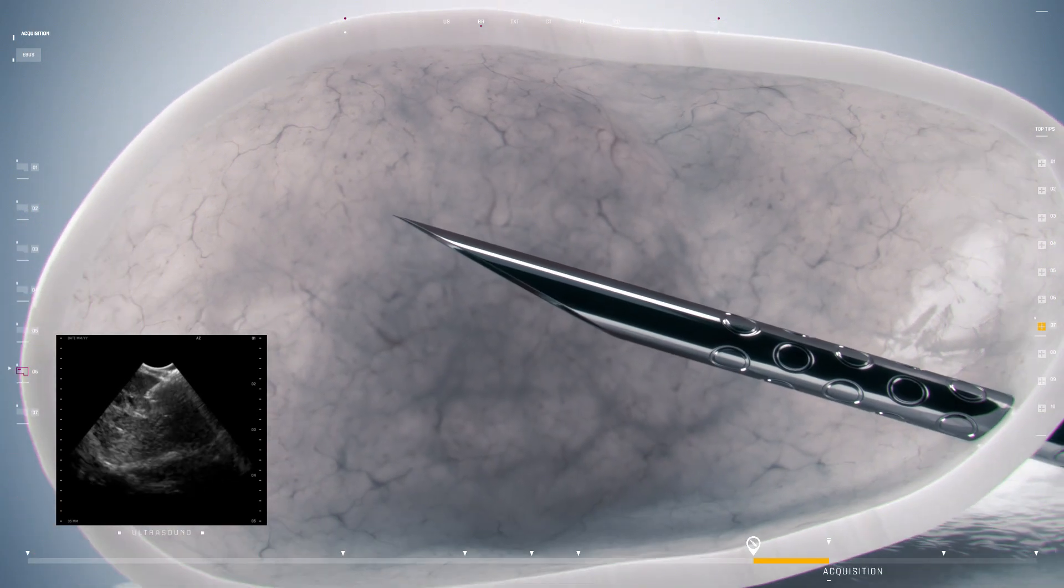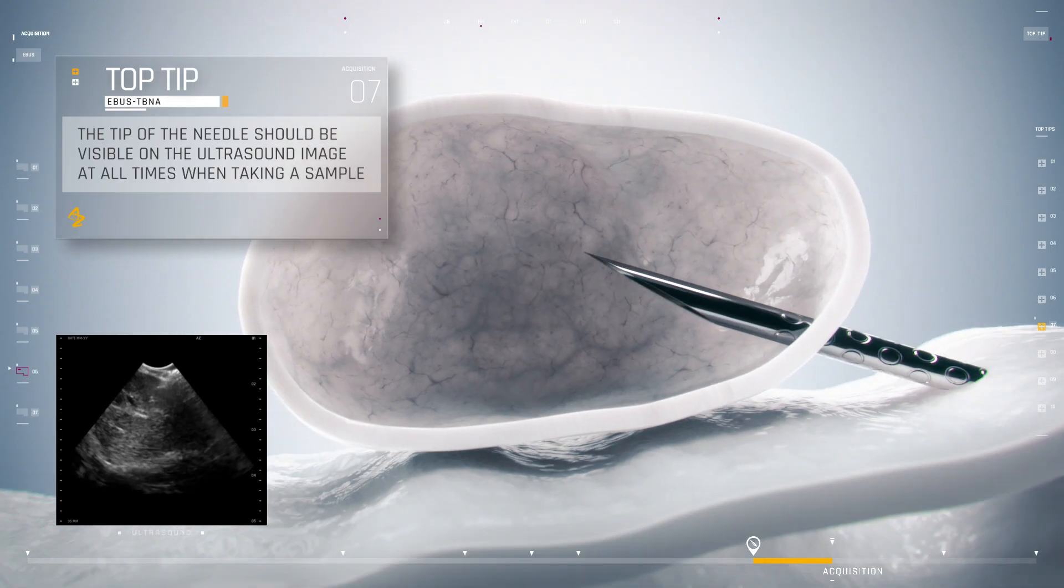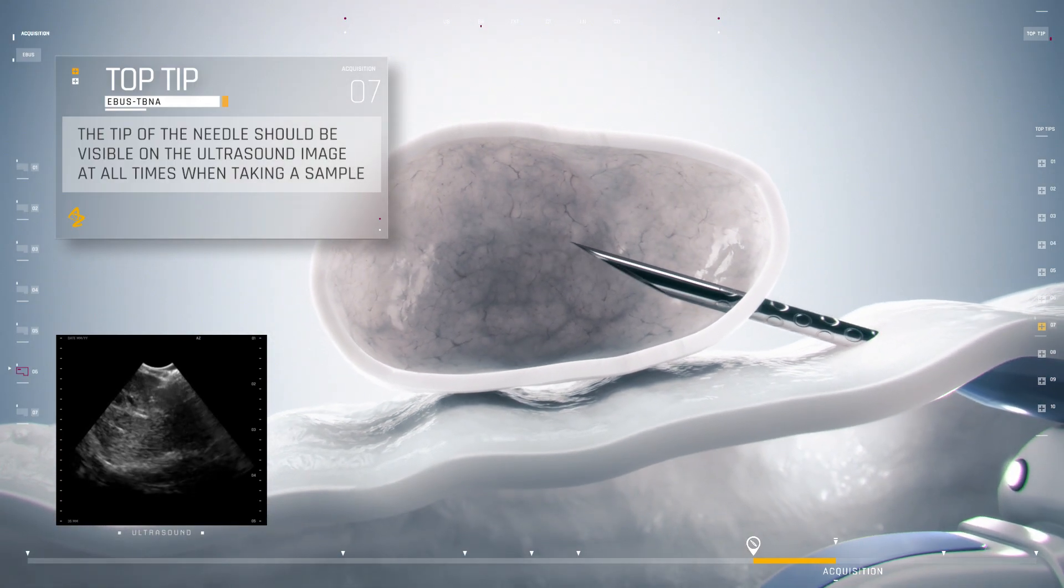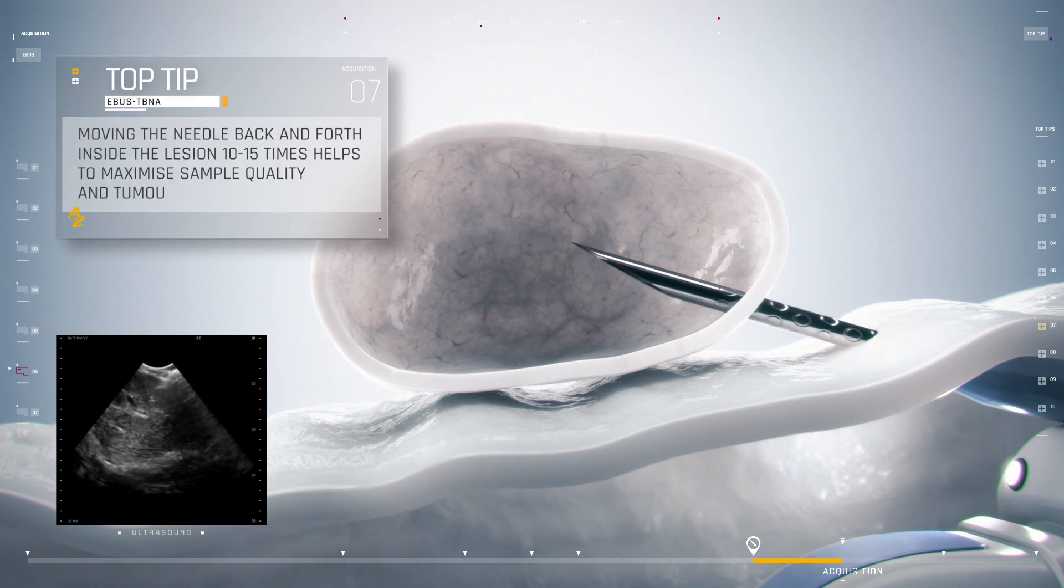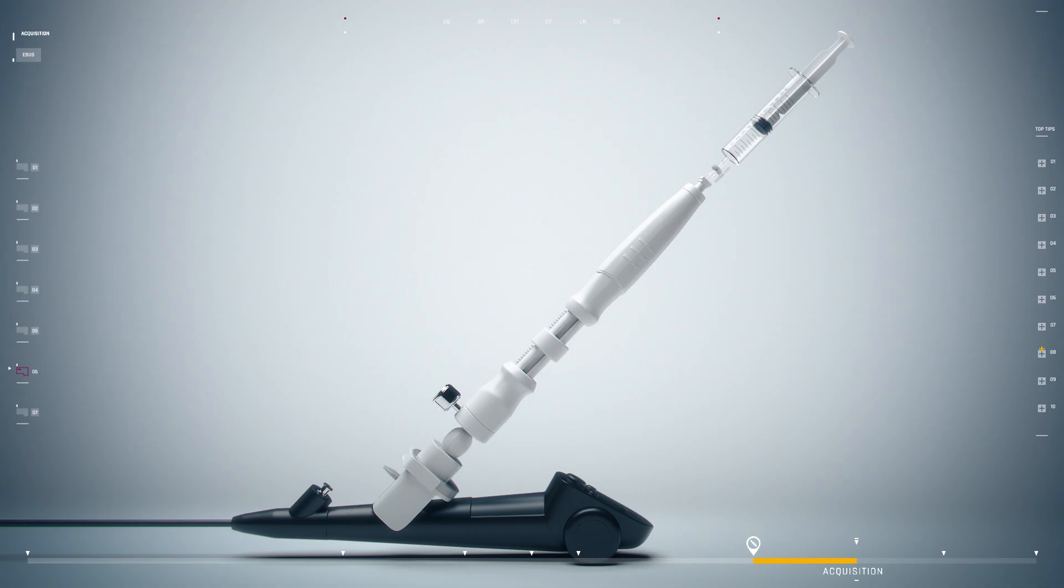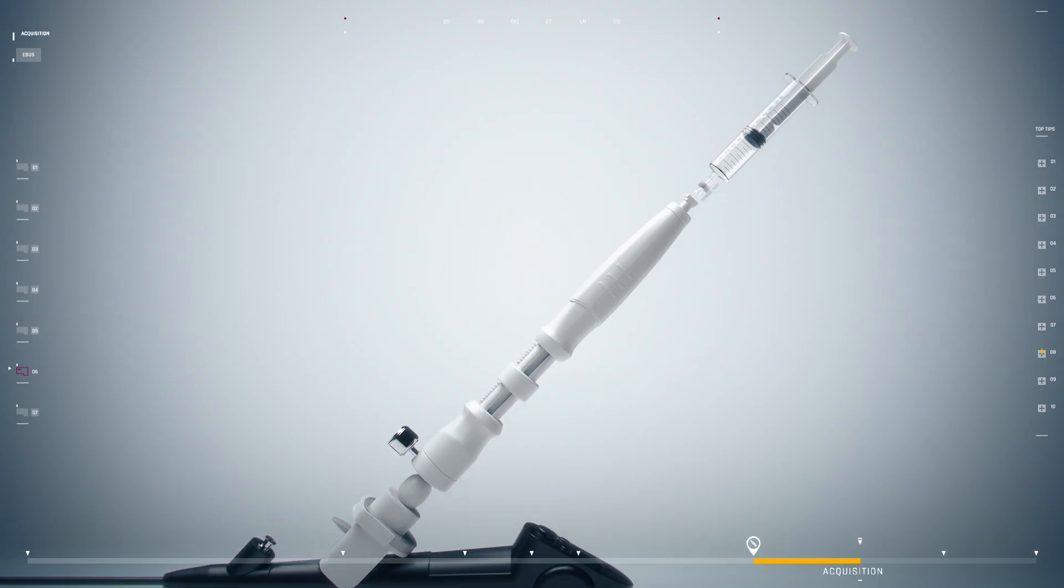Sample collection is performed by moving the needle within the target lesion while suction is applied via a syringe attached to the proximal end of the needle. When taking a sample, the needle should be moved back and forth for 20 to 30 seconds or 10 to 15 times.